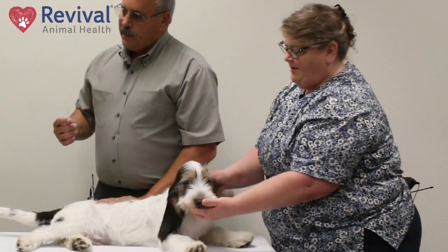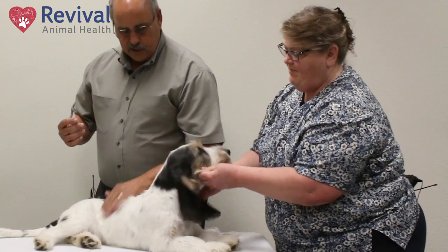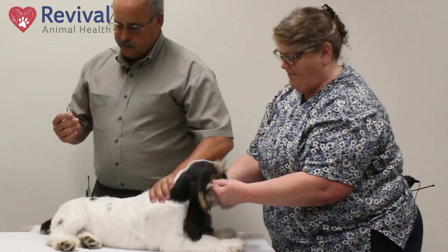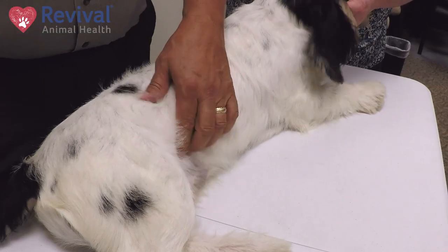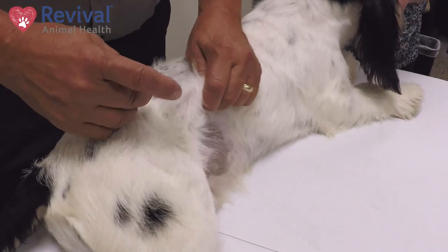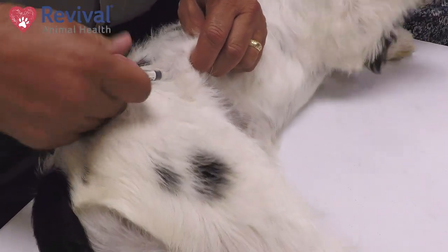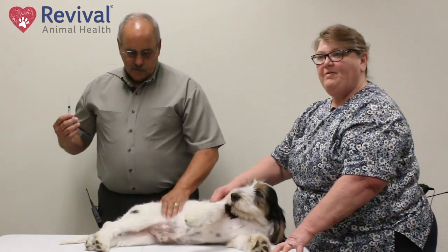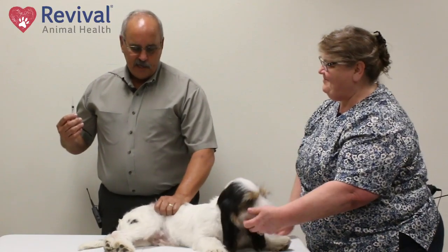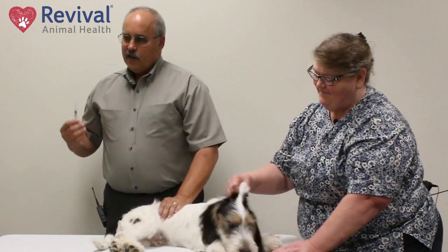The second place to inject them — and I do it a lot with big breeds — is right here in the flank. There are fewer nerves here than in the neck, but most people find the neck easiest. For large breeds, I just pull them up against me, let them know where I'm at, do the needle with the tent, slip it in, give the vaccine, pop back out, and rub it in. That's all you have to do. It's easier for me on large breeds that are standing next to me, rather than on a table, to do that flank area.